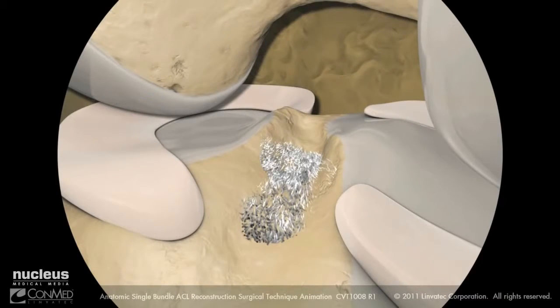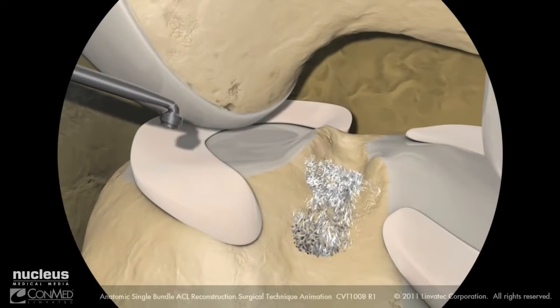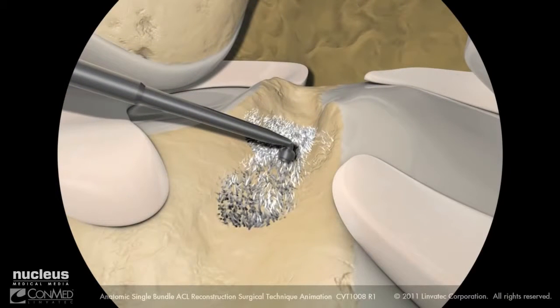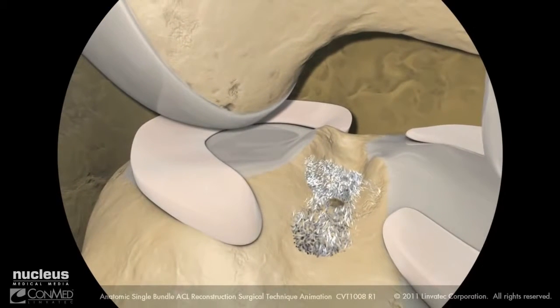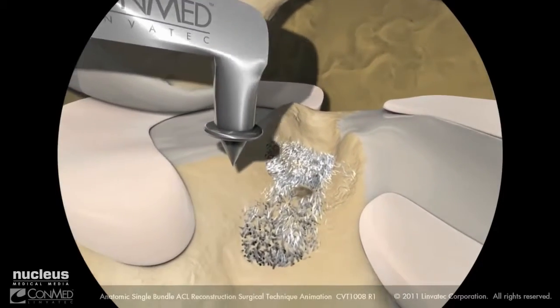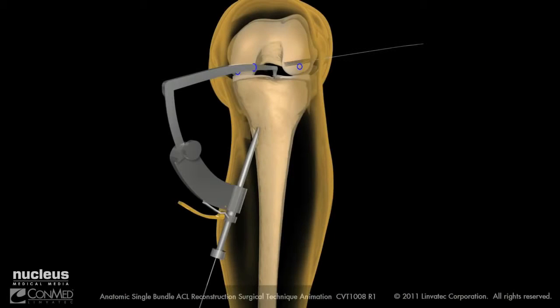Switch the arthroscope to the anterolateral portal. Next, insert the light wave ablator into the anteromedial portal to mark the center of the tibial ACL footprint. Set the angle of the pin ACL guide to 55 degrees. Insert the tip into the anteromedial portal, placing the tip of the guide into the center of the tibial ACL footprint. Advance the external guide sleeve flush to the anterior tibial cortex.